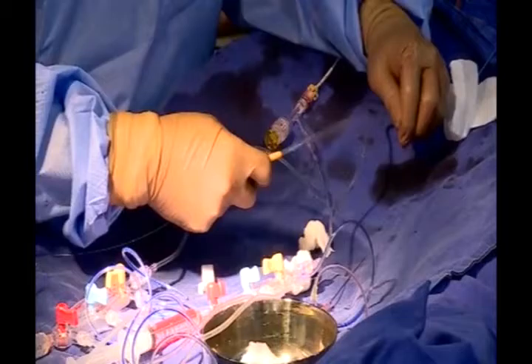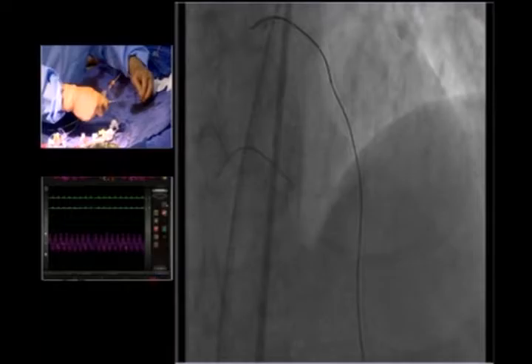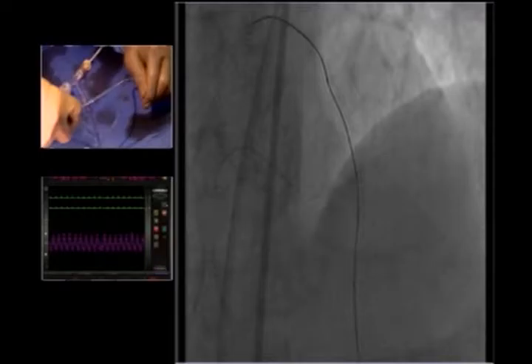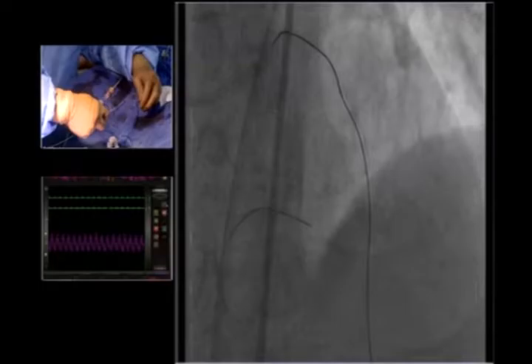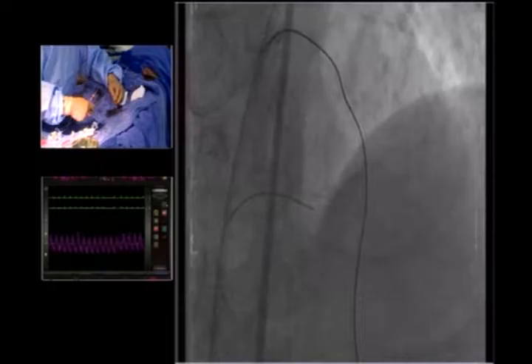And I have to put the torquer device at the end of the Tornus. And by using my small fingers, I keep this one like this, yes, not to rotate. And then counterclockwise rotation I'm applying. But for this particular case, it's very severe. Even applying counterclockwise rotation, I cannot advance this device even by 1 millimeter. I cannot push.